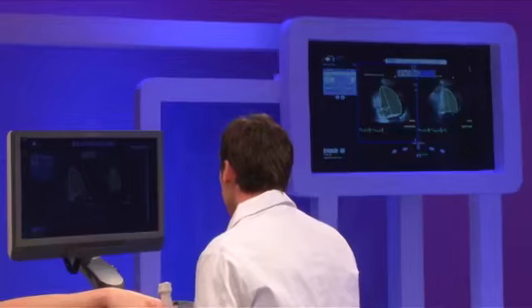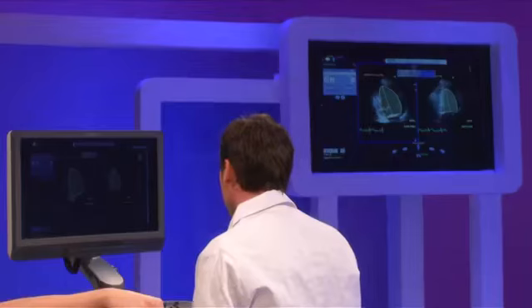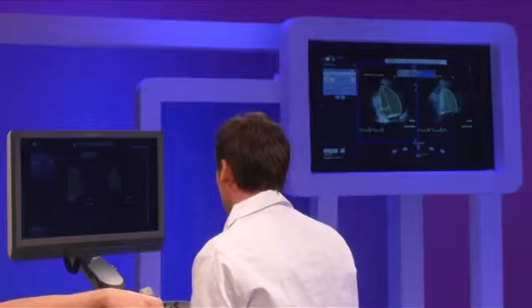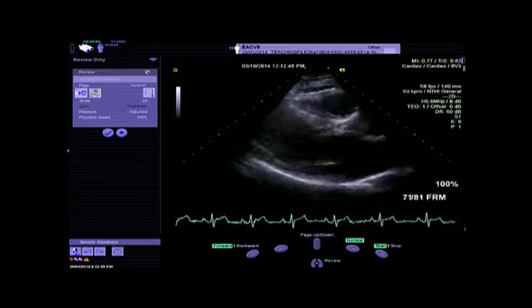So now, just to show you the measurement of the mitral annulus diameter, which is very important in these patients, I will try to pick up the images regarding the parasternal long axis view and show you how to measure these parameters. So let me try to take the image that we recorded regarding the parasternal long axis view. And here you have your parasternal long axis view. And what you need to do is just the measurement.